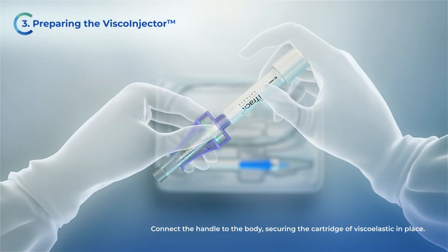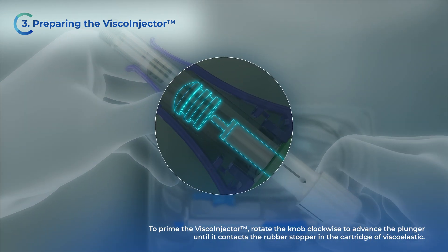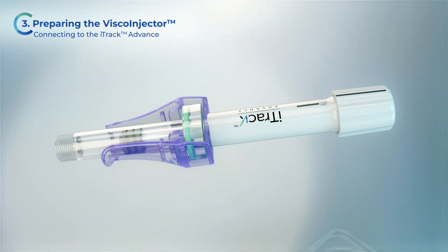Connect the handle to the body, securing the cartridge of viscoelastic in place. Rotate the knob clockwise to advance the plunger until it contacts the rubber stopper in the cartridge of viscoelastic. The VSCO injector is now assembled.